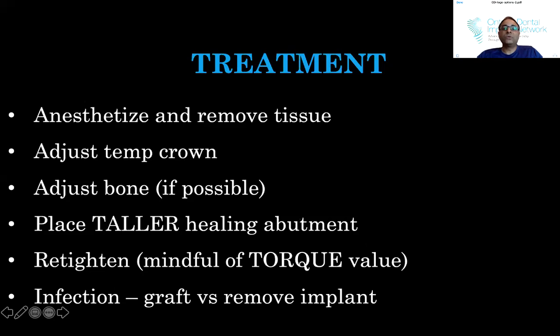And if it was loose, then you may just want to put a cover screw in at the end of the day. And if there is infection as a result of it, then you have to regraft that area, because sometimes bacteria can get into those sites. This may happen when you're doing an implant with simultaneous grafting.